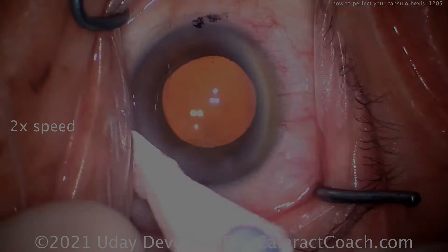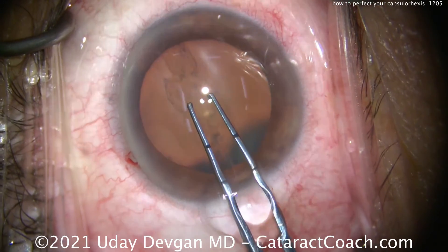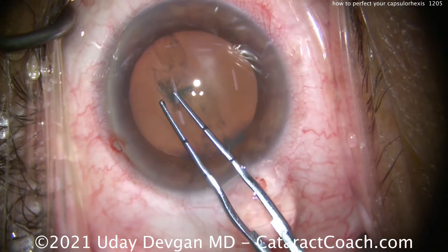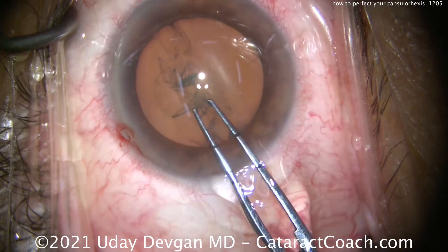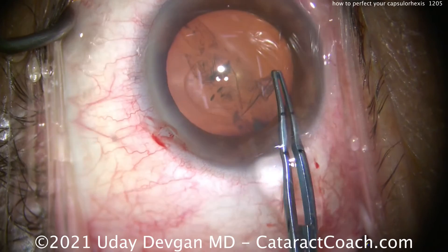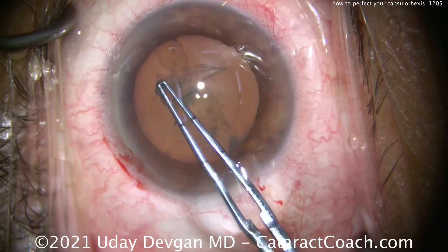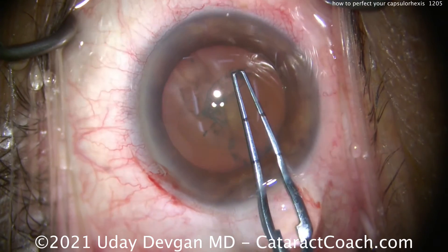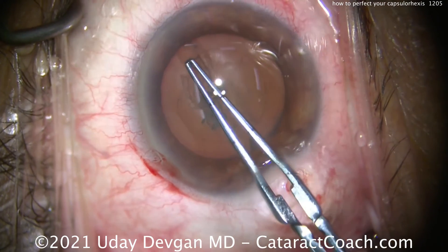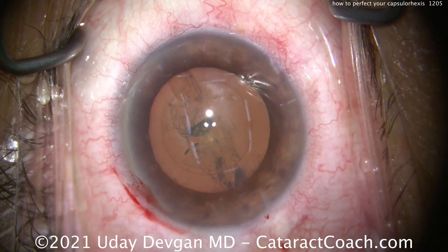Let's review that one more time with another case. Here's another patient — starting off measuring, which shows me where I need to make it. I poke in, start the rexis, and here's where I'm going to spiral it out to get the size I want. Continuing at that desired size, bringing it over, and trying to make it as round as possible for a perfect, beautiful result. At the end, don't pull centrally — rather continue the curve. Nice looking rexis.